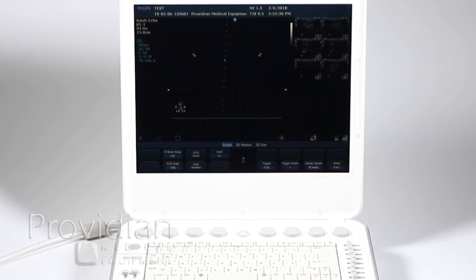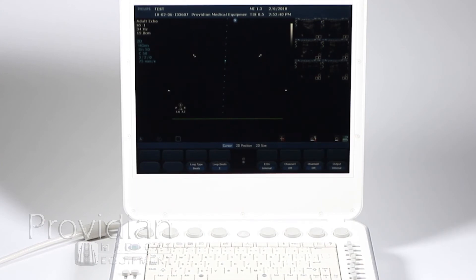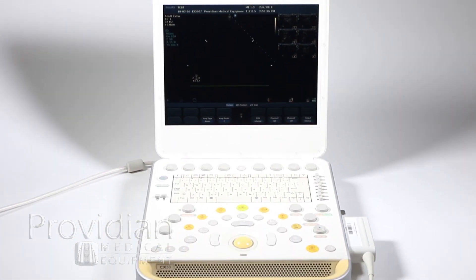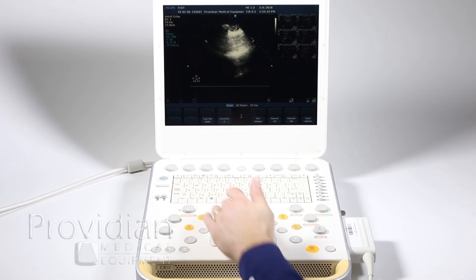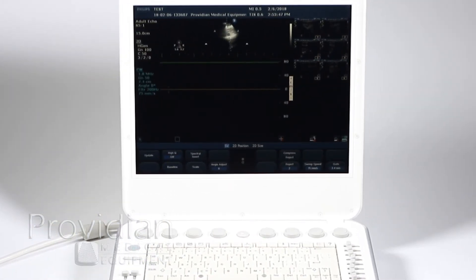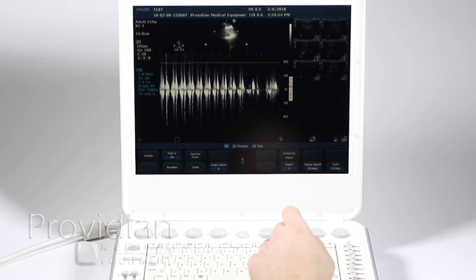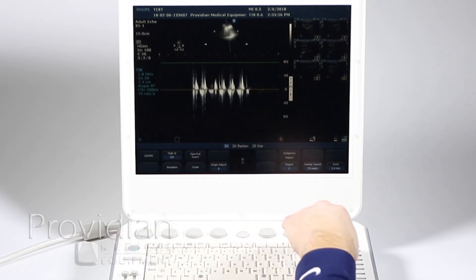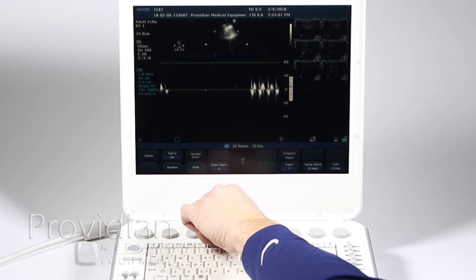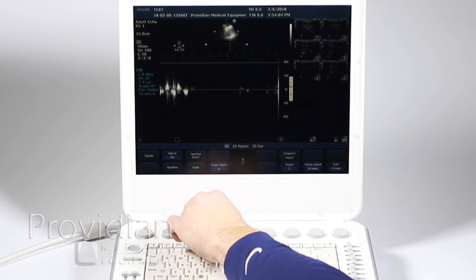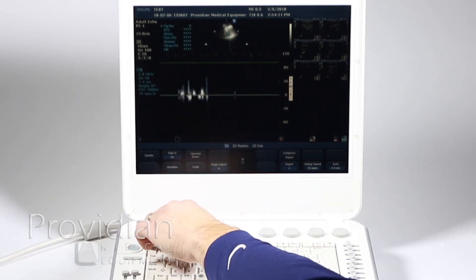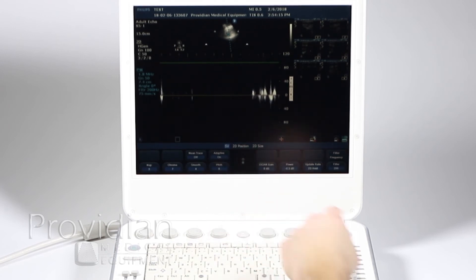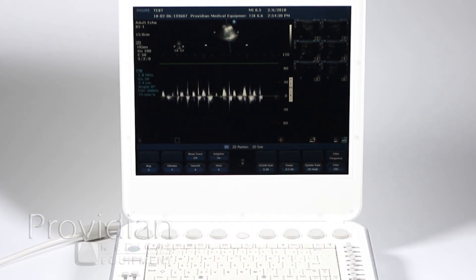Going to page two — this is the same as the other. I'm just going to put this probe on my hand to give you an image. Hit PW Doppler and we have our gate up there. Again, you can change your sample volume position and size. You have your update to go back and forth from 2D. You can adjust your angle of that gate, your scale, move your baseline, turn off the auto calculations. Compression rejection — all these remain the same. You just don't have the angles that you would find on the linear transducer.